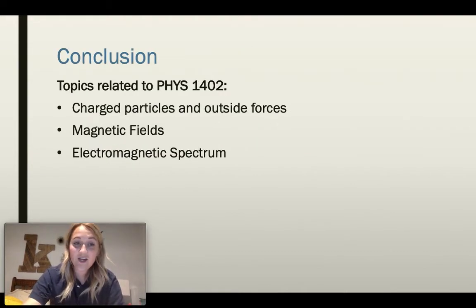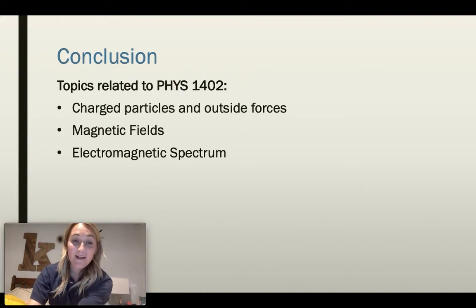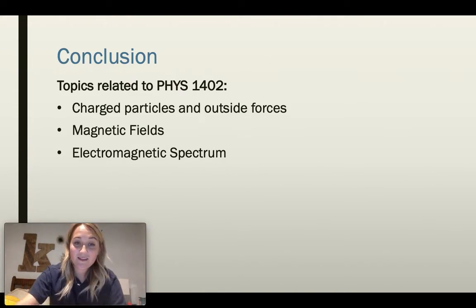In conclusion, the topics related to Physics 1402 that I used are charged particles and outside forces, which in this example was protons, and the outside force was magnetism. Magnetic fields are also discussed, since an MRI machine is basically a big magnetic field in itself. And the third topic that I discussed was the electromagnetic spectrum, specifically radio waves and their effect on hydrogen atoms in the body. Each of these topics relate to each other in the process of magnetic resonance imaging to assist healthcare professionals in diagnosing their patients. MRI machines are just one example of how physics is used in the everyday world.